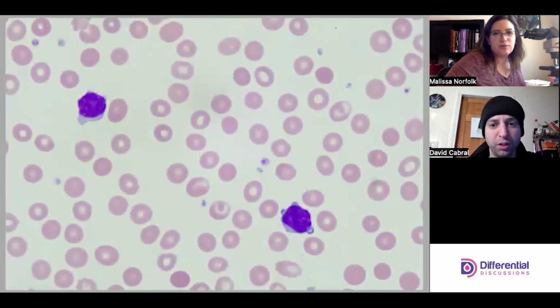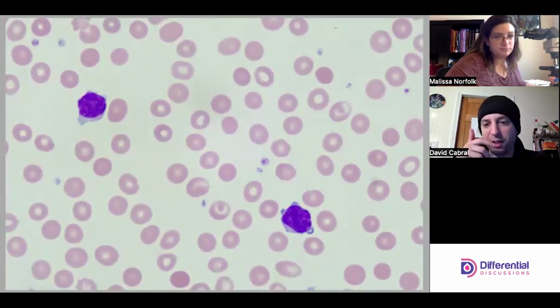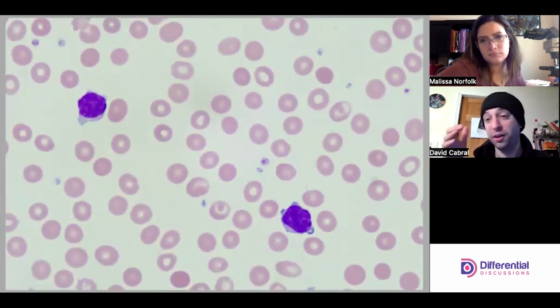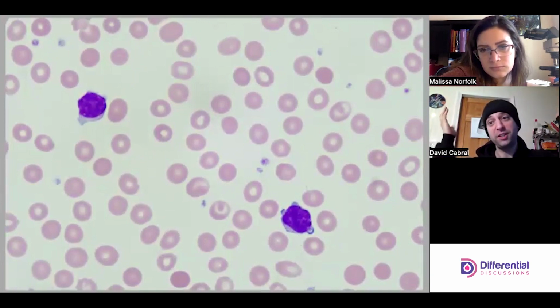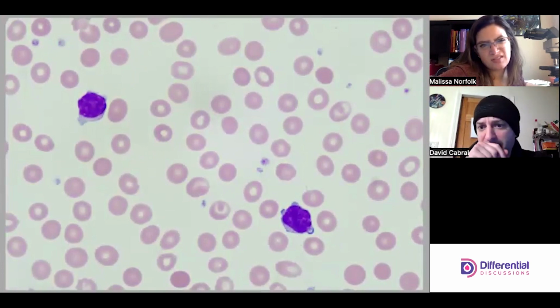All right, two lymphs. I'm stopping because of the blebs. Yeah, the blebs. So my face crunched up a little bit, right? Hairy cells are supposed to do projections, but inherently there's some kind of issue that causes the cytoplasm to look weird. So now these blebs are kind of weird. But you can have a totally normal patient with lymphs that have little blebby things. So just being careful, I think the blebs I would just call a lymph. Yeah, lymphs, I would look for 100%.